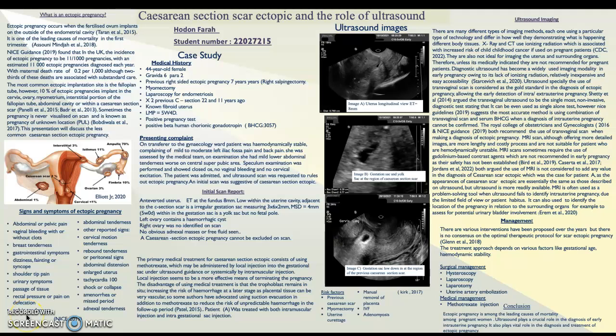The patient was informed of the potential caesarean section scar ectopic. Images were discussed with consultant radiologists for gynaecology, who advised a rescan in a week. As the patient was hemodynamically stable, she was discharged home with a repeat beta HCG in 48 hours and a rescan in a week. Beta HCG hormones remained static, and rescan confirmed delayed miscarriage 16 days after the initial scan. However, scan findings were still suggestive of caesarean section scar ectopic. Medical management of ectopic pregnancy was commenced.